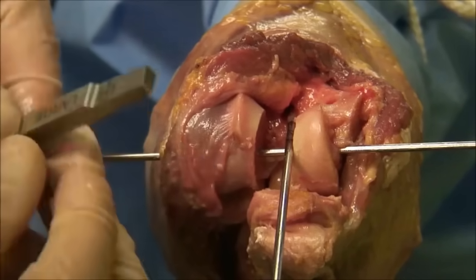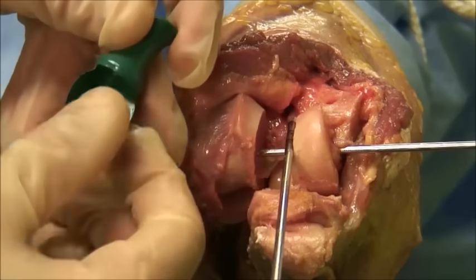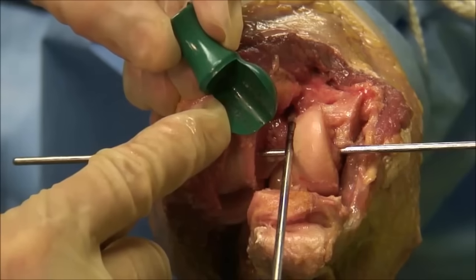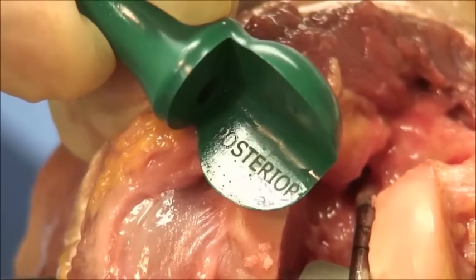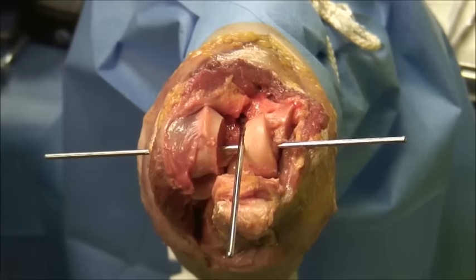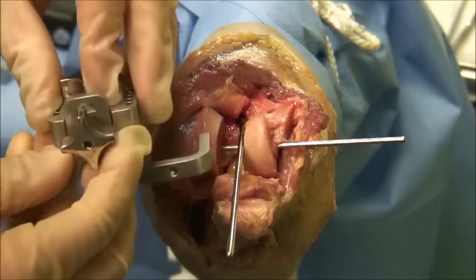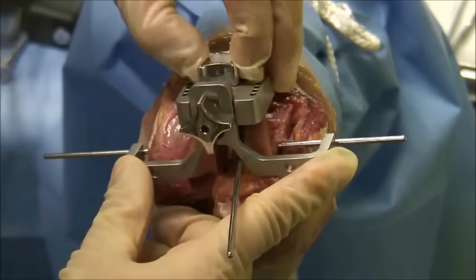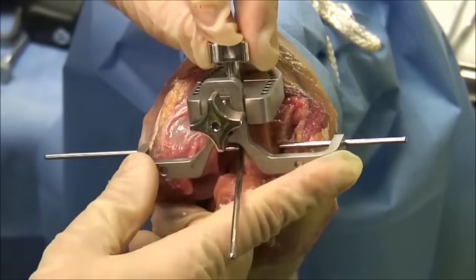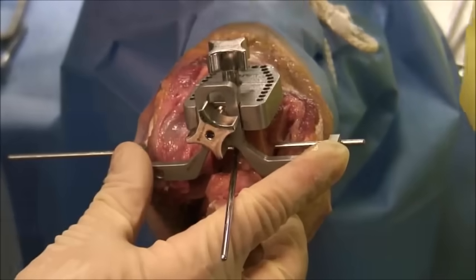Using a probe, the distance between the two wires is then tested, which now correlates with large — a green testing bushing. For further preparation of the humeral canal, the aiming device is put on the wire through the center of rotation and then applied on the posterior side of the humerus, which has to be parallel to the axis of the humerus itself.